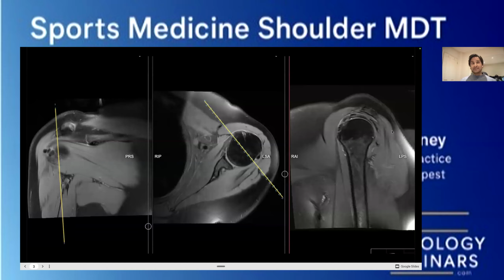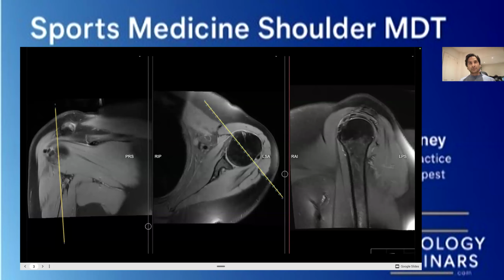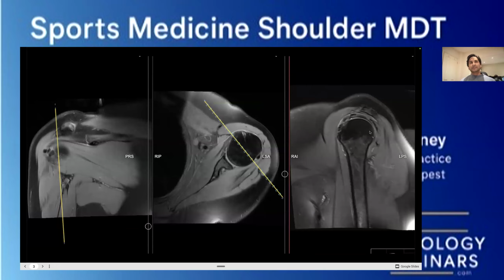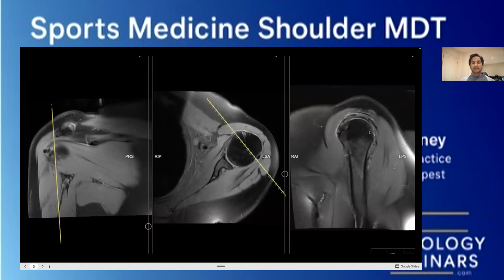But what I would say is have a look at it from the side view and imagine the face that I drew earlier, and also draw that hair out. So you've got the sideburn, and then you've got that sort of top bit of hair there. Just make sure that it always seems like a sheet all the way along. As you scroll through and as you get used to it, you'll start to notice that little bits may be missing. It looks a bit thinner in some areas and then others, like maybe someone's got the clippers and not gone all the way across. You'll notice little bits there that don't look quite right. But for me anyway, I find this particular view the most useful view to find the rotator cuff tendons and really assess them.